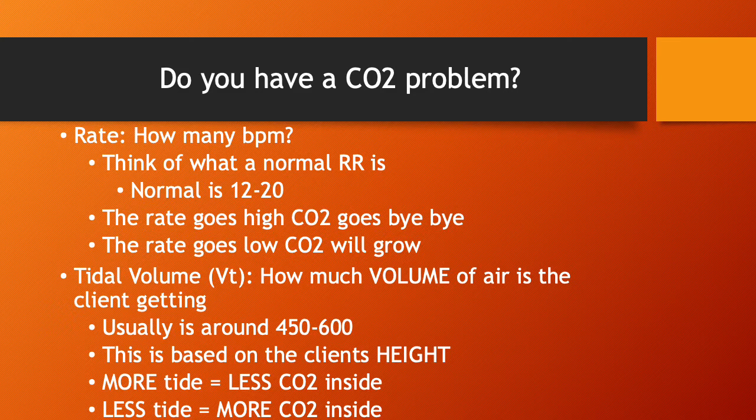So this is just really saying, when we're looking at these settings, I just kind of want to know what my patient's on. I can't look at a setting and say this is right for the patient just by looking at the setting. I have to look at their blood gas. I have to see how they're breathing. So that's really our role as the nurse. We're just looking at these settings and seeing, is this working for my patient? Is it doing what it's supposed to do?